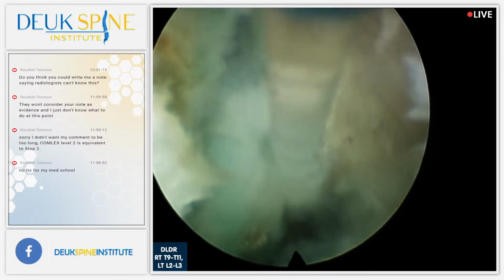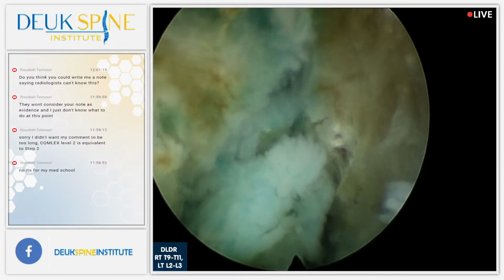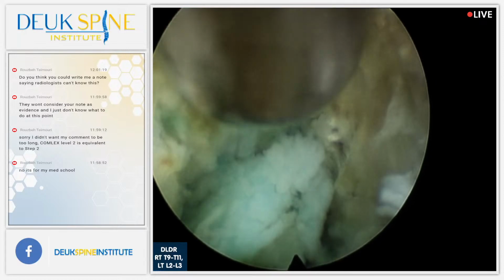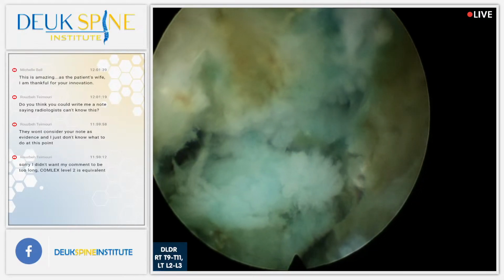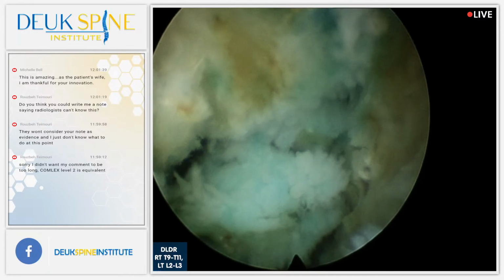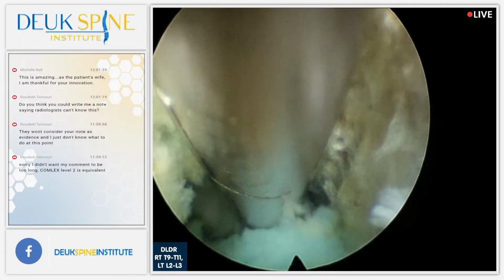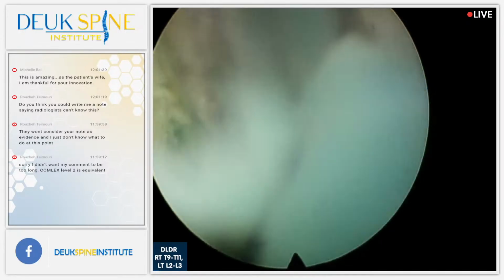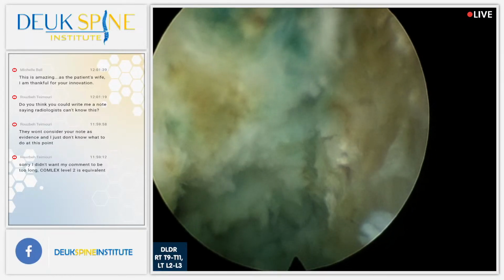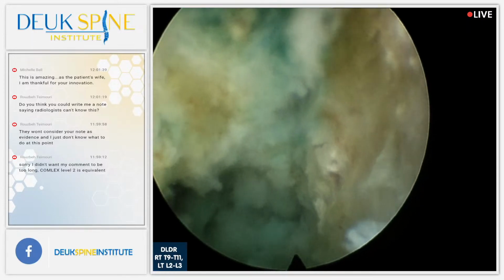There's a piece of herniation there I need to get out. You guys see it? Yes, we do. It's just stubborn. A lot of these fragments of herniation are stuck down to the annular tear. You see where it's stuck down right there at the roof at 12 o'clock? There's a little attachment. That's scar tissue holding it there. So I use the laser to remove that scar tissue and loosen up the herniation, and I can pull it out. This one is not quite ready to come out, apparently. Maybe it is.